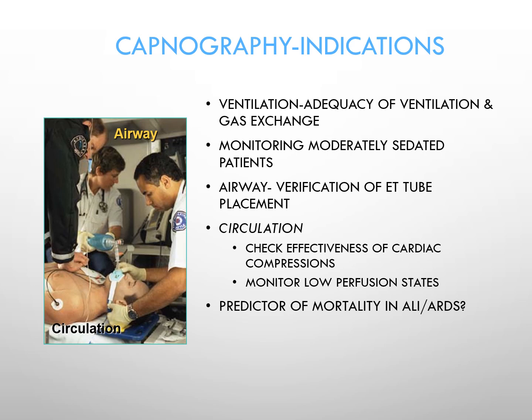An additional indication, and somewhat newer than some of the older traditional ones, is to check the effectiveness of cardiac compressions during a resuscitative effort. With all else constant, the better the compressions, the higher the CO2 level that is going to be indicated on capnography.